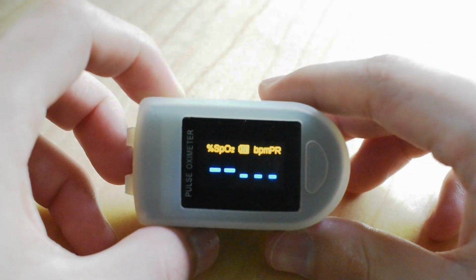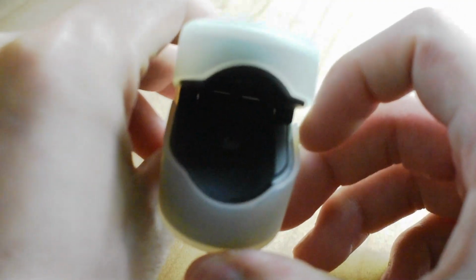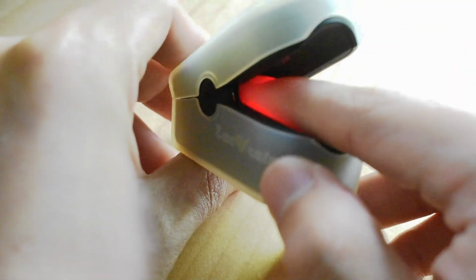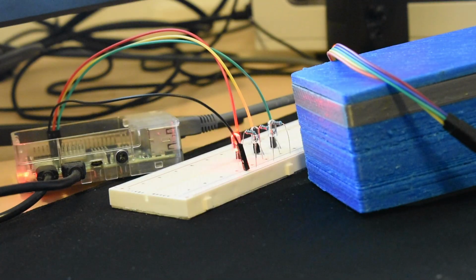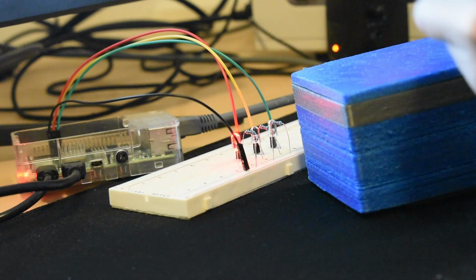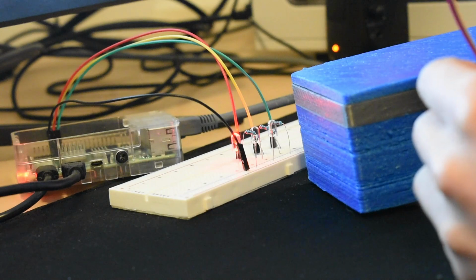During this demonstration, I wanted to go over some of the capabilities of our medical device known as the Predictive Pulse Oximeter. Traditionally, pulse oximeters make use of a red and infrared LED accompanied by a photodiode in order to calculate the heart rate and blood oxygen saturation of the patient in real time. Team Lifeline wanted to make modifications to this system by introducing a predictive element using machine learning. The predictive pulse oximeter will predict the risk of hypoxemia of the patient at any given time.